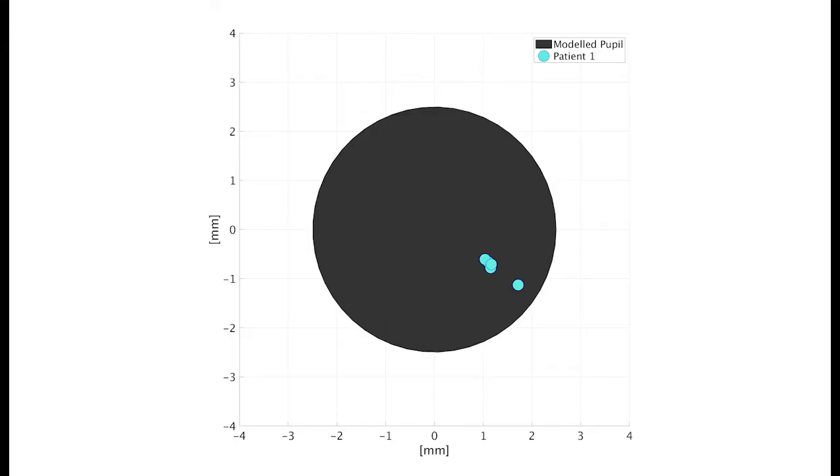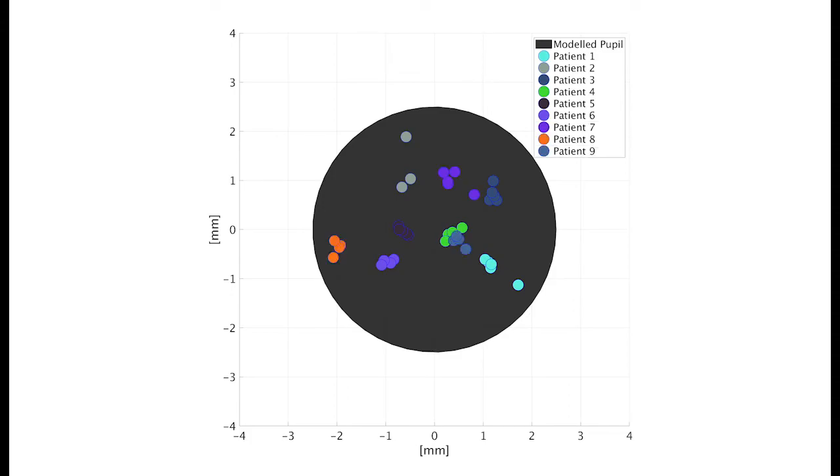In addition, we quantified the discrepancies between the ETS measurement of the pupil and its absolute position on the geometrical eye model. Even though we measured differences below 2.2 mm, a clear patient-specific bias could be observed.